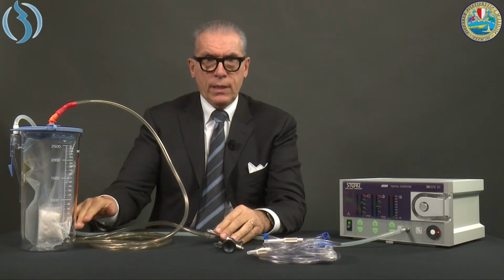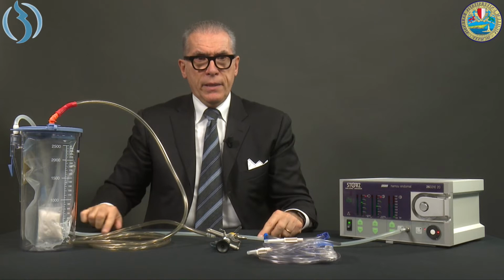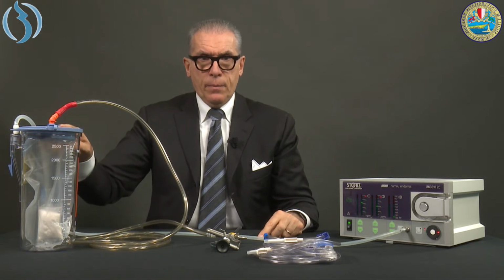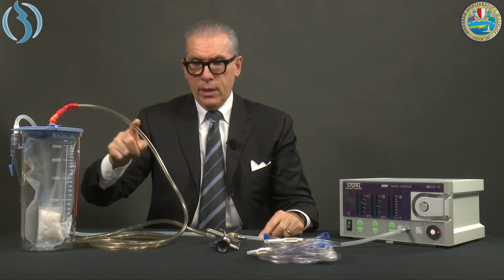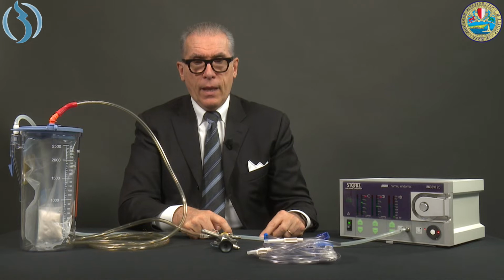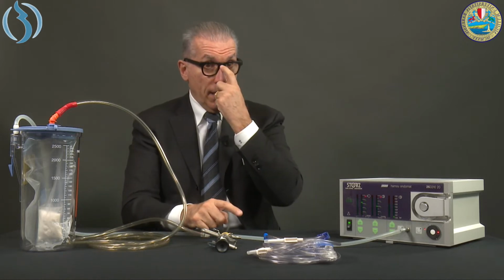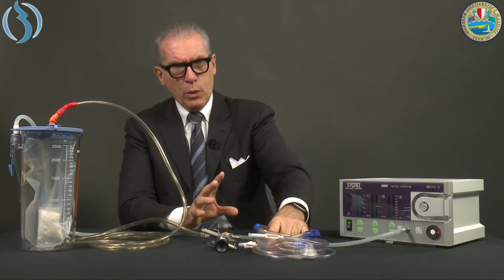Okay, so the aspiration system has been connected: aspiration of air into the receptacle, vacuum, and air sucks the liquid, aspiration of liquid from the resectoscope. Now we have to connect the irrigation tubing set. That looks a little bit more complicated.